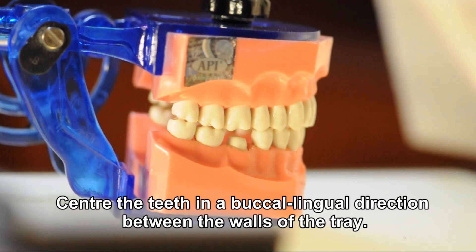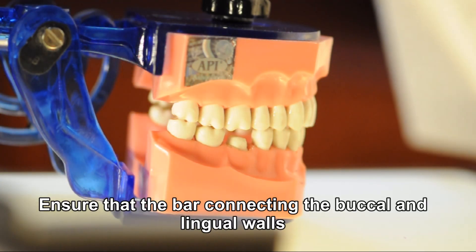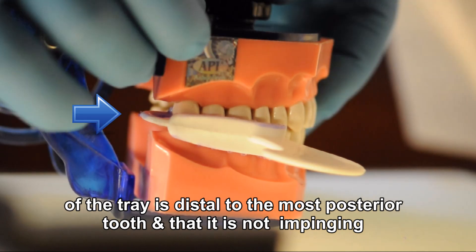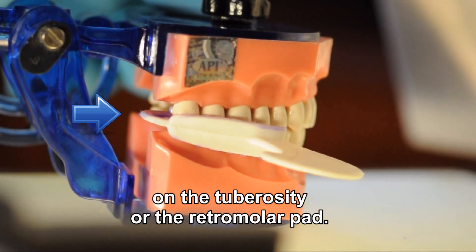Center the teeth in a buccal-lingual direction between the walls of the tray. Ensure that the bar connecting the buccal and lingual walls of the tray is distal to the most posterior tooth and that it is not impinging on the tuberosity or the retromolar pad.